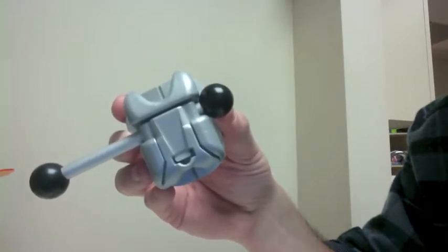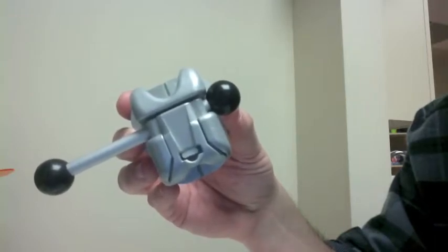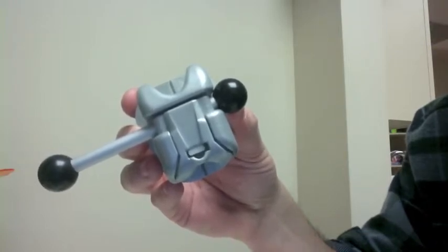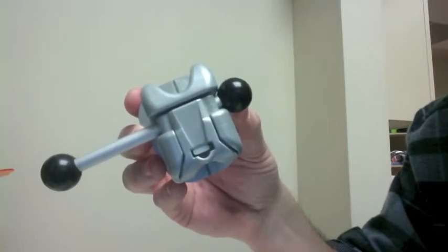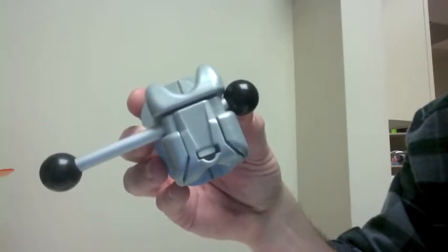So why is that important? Well, light forces are obviously more comfortable. The teeth don't hurt as much. Light forces are healthier for the roots of your teeth and the bone that surrounds the roots. And light forces also move teeth a little faster. So instead of the old 2 to 3 year treatment time, we can now treat most of our cases in about 14 to 18 months. So there are a lot of advantages to this light force technology.